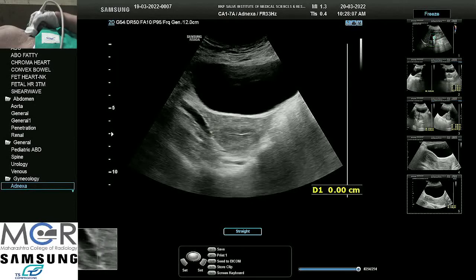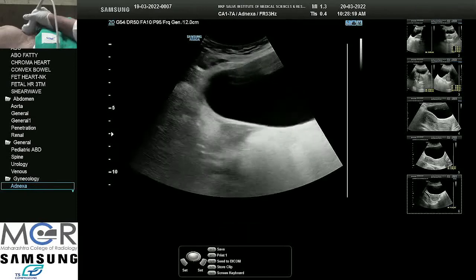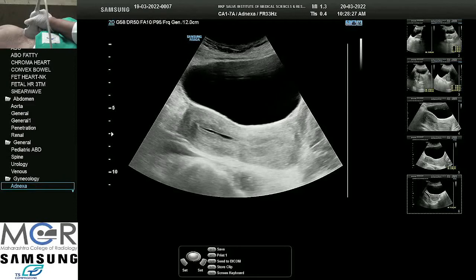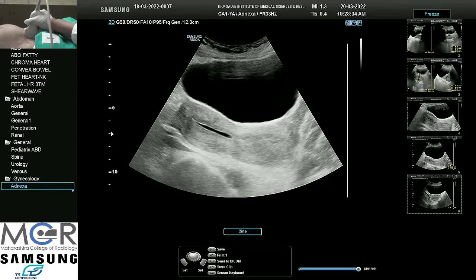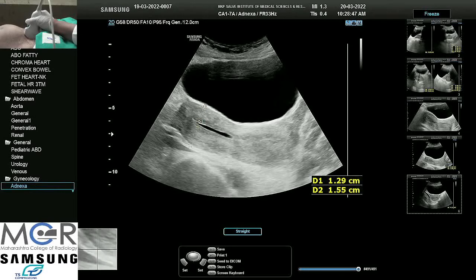The transverse diameter is measured like this. For endometrial thickness, we can see that the uterus has a homogenous echotexture. The anterior myometrium and posterior myometrium are well seen. If possible, we should take measurement of the anterior myometrium also, because then we can rule out adenomyosis if the thickness is more. This is absolutely normal thickness anteriorly and posteriorly. As mentioned in our previous talk by Dr. Doak, we are just trying to demonstrate these measurements.